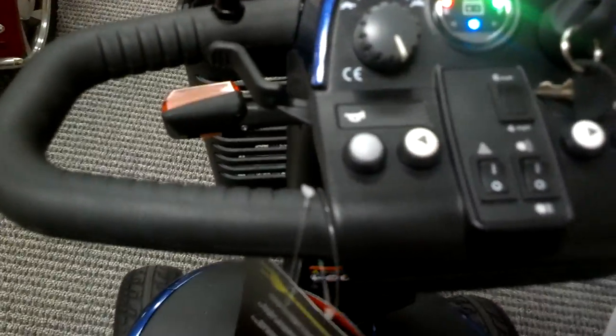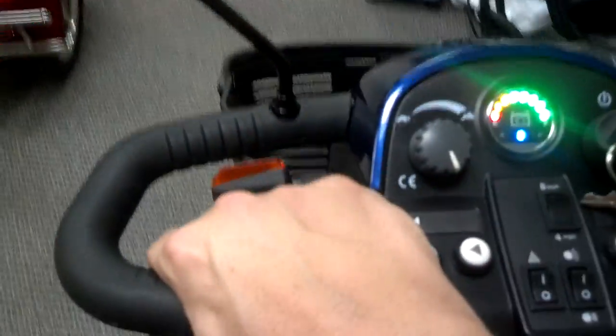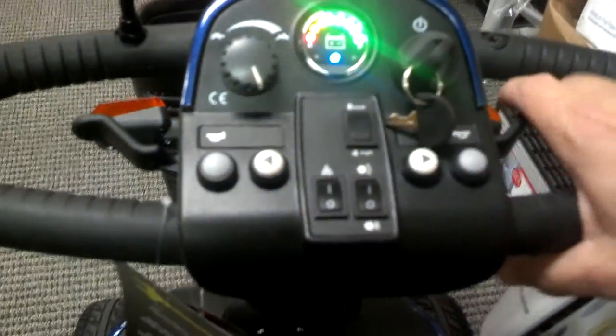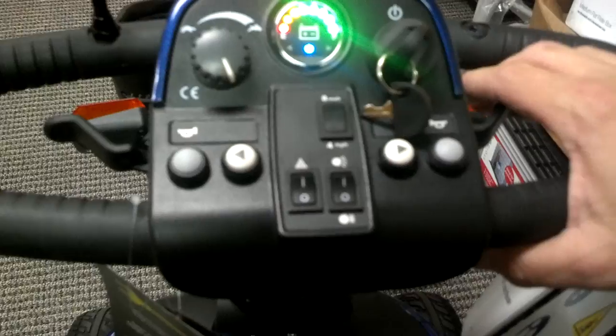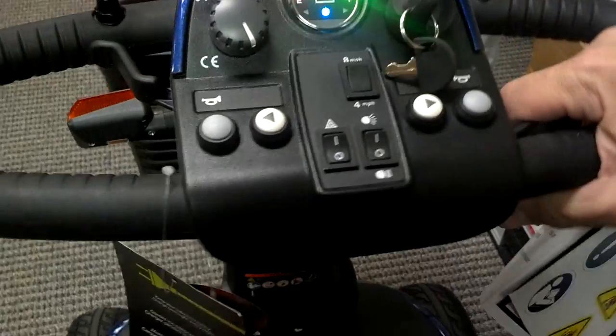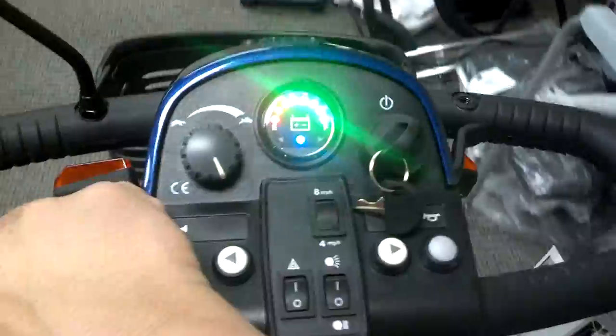I'm going to go ahead and drive it for you so you can get an idea — that gives you an idea of how simple it is to drive. We have this total package listed on our site for $1,997, and the lowest price we see online is $1,997, but it does not include the back basket and white glove delivery service. I highly recommend checking it out at GoSouthernMD.com.